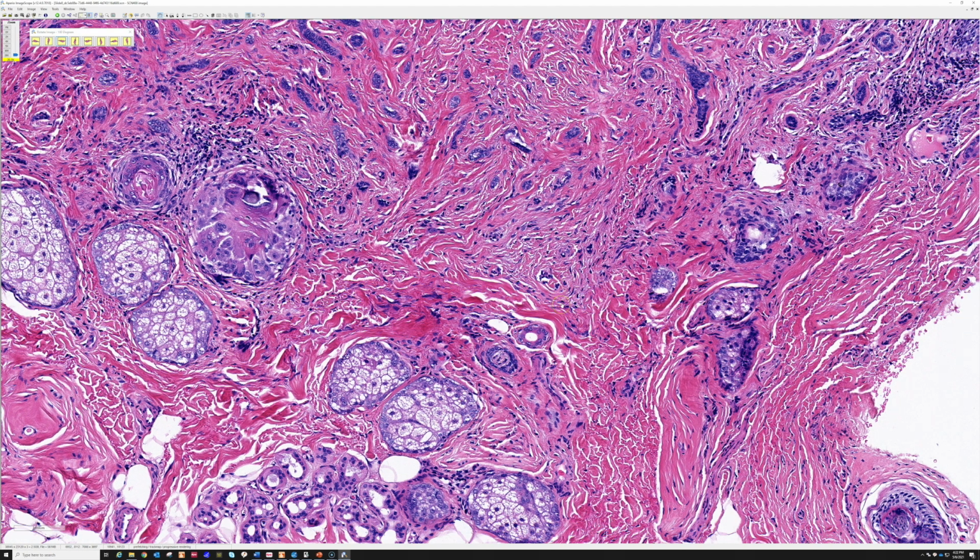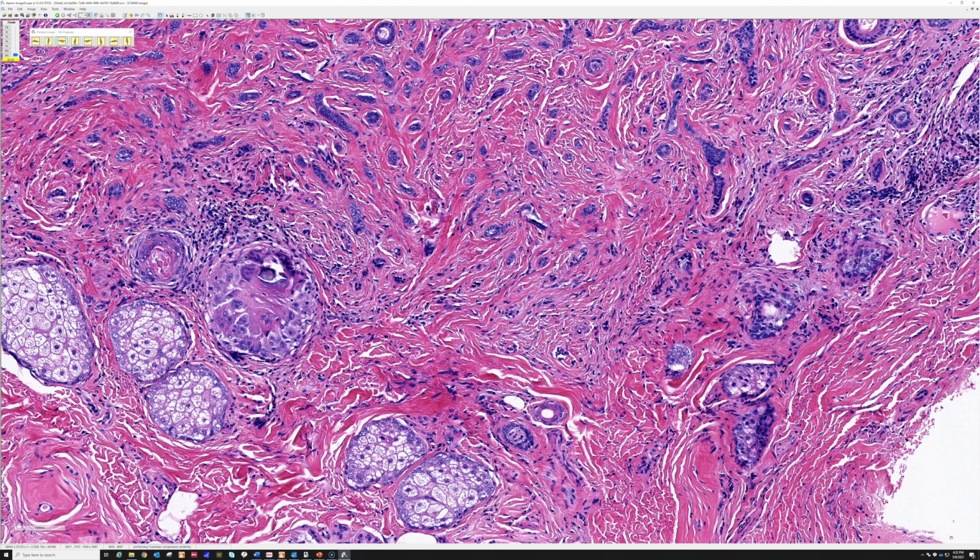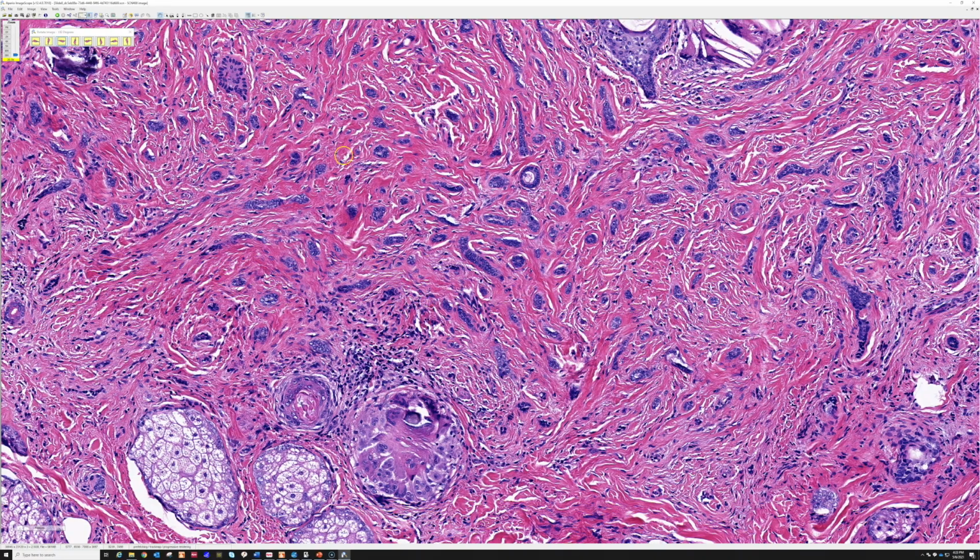So they presented in that paper, and it's by Dr. Yedrick and Dr. McNiff and colleagues, and they did a very beautiful job of highlighting several cases, I think they had 6 or 7 if I recall, that were desmoplastic trichoep and had perineural, they don't call it invasion, but involvement by tumor cells, and yet had no recurrence and no bad outcomes. And I felt that they handled it so beautifully in the discussion that reading that paper changed my view and my practice on these. And in fact, in this case here, this spared this young woman from having a decent sized chunk cut out of her face, which is what would have happened if I would have called this microcystic adnexal carcinoma. And this was several years ago, at least, and to my knowledge, nothing bad has happened to this patient.